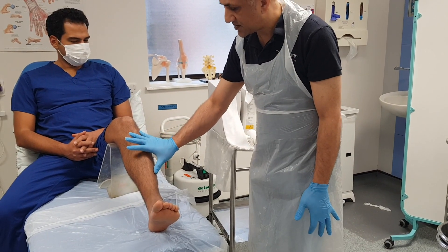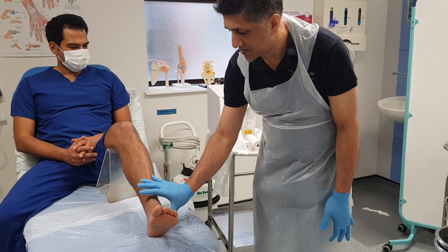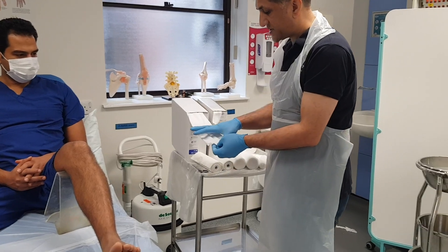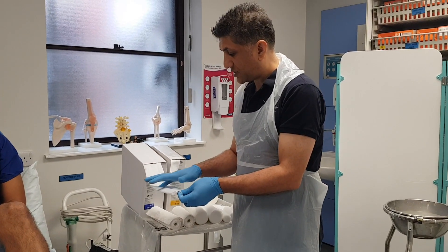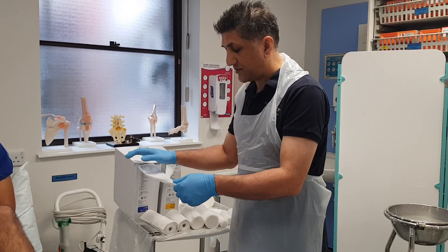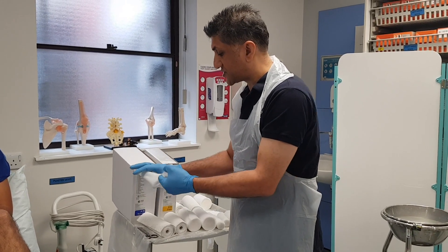I'm going to first measure out the stockinette. I'm going to measure from the fibular head — one hand span, two hand spans, about three. I'm going to measure four in the stockinette because this tends to become shorter as it's stretched sideways.